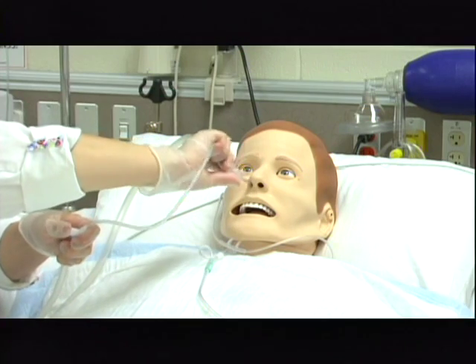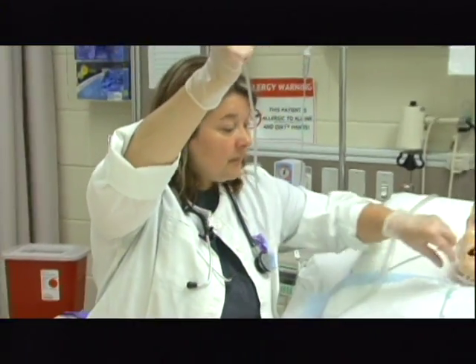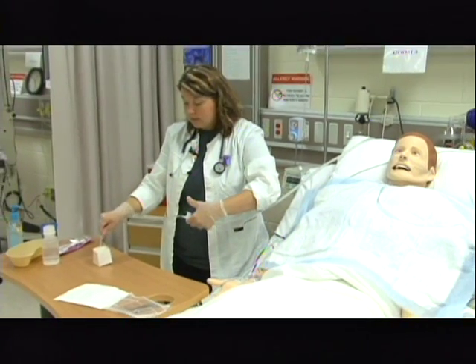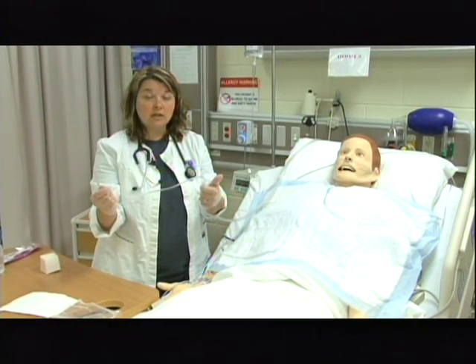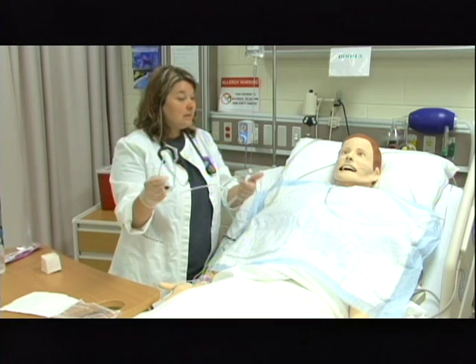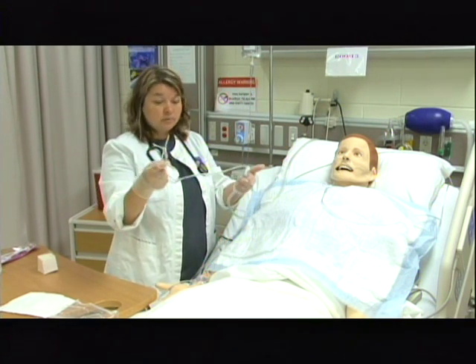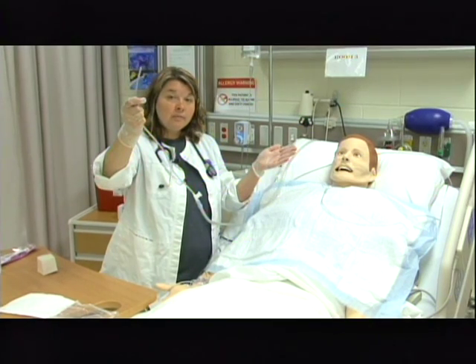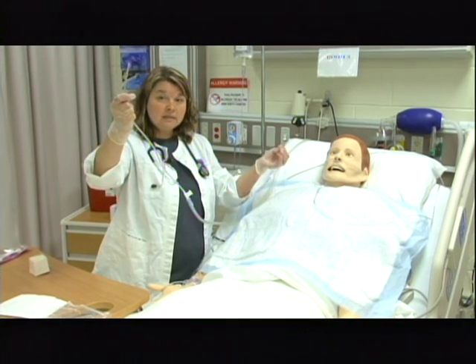I'm going to apply suction intermittently while twisting and pulling the tube out. Once I'm out completely, I hold this hand up and reapply his oxygen with my clean hand. I move over and suction out any secretions in the tubing, then let him catch his breath and assess the need for further suctioning. I need to make sure his pulse ox is within an adequate range, that he's not in distress, and ask if he needs more suctioning. I cannot listen to breath sounds at this point as I don't want to become unsterile — I'll do that at the end of the procedure. Maximum of three suction passes; suction no longer than 10 seconds per pass.